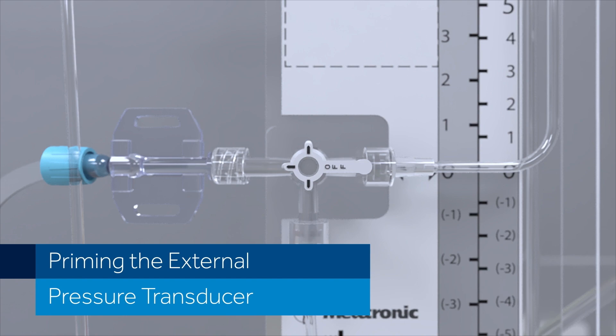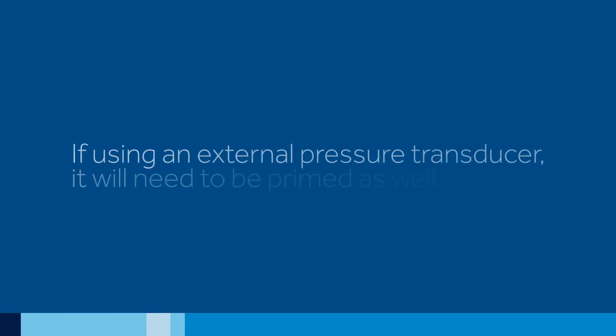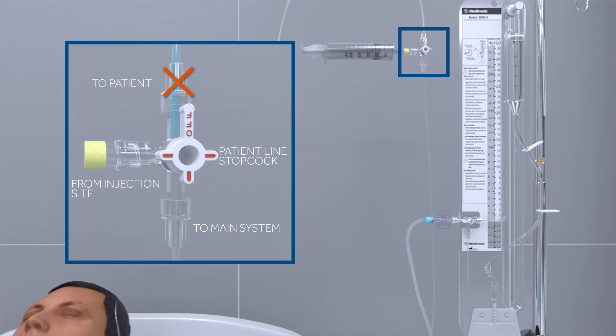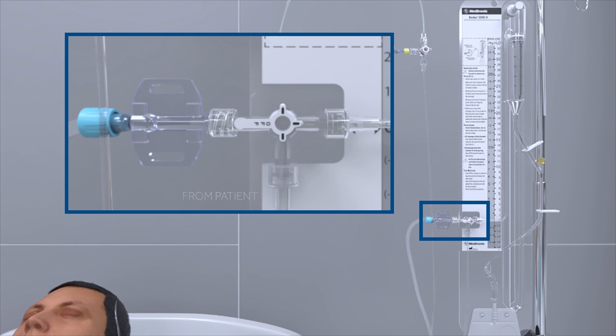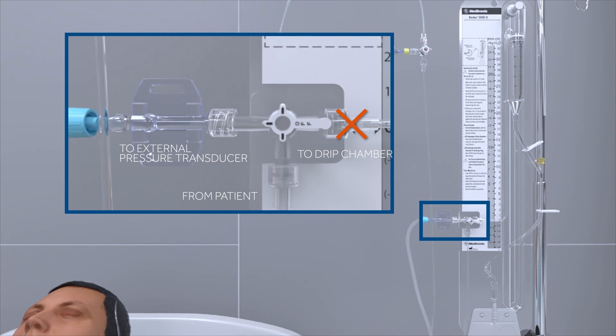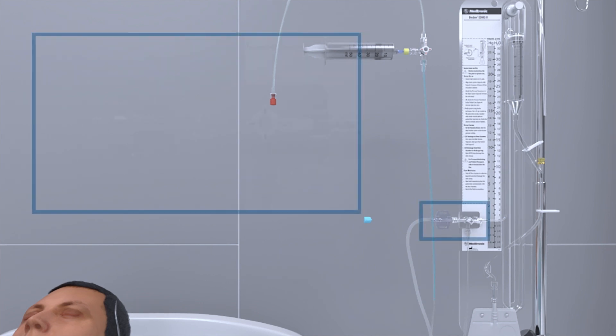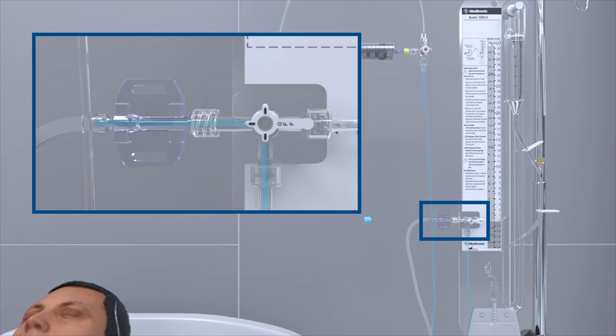Priming the external pressure transducer. If using an external pressure transducer, it will need to be primed as well. Make sure the patient line stopcock is positioned so that fluid can be pushed from the sampling site in the direction of the drip chamber. Rotate the main system stopcock so that it is off to the drip chamber, allowing fluid to be pushed to the external pressure transducer. Using sterile technique, loosen or remove the end cap on the transducer. With the syringe still connected to the patient line stopcock, push the sterile saline solution through the inner tubing of the transducer and ensure that all air bubbles have been removed.